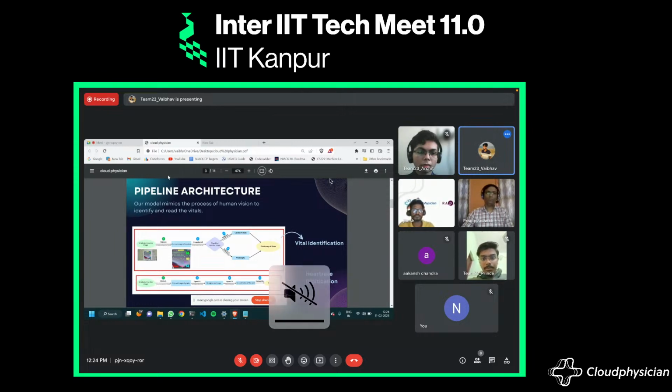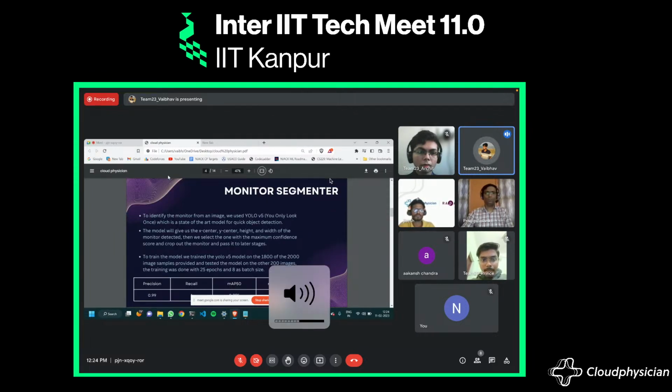So let's dive in. For the monitor segmentation part, we have developed a monitor segmenter that uses YOLO v5, which is the current state-of-the-art model for quick object detection. The model is trained to detect ECG monitors in images and output the X center, Y center, height, and width of the monitor. By using this information, we can crop out the monitor.